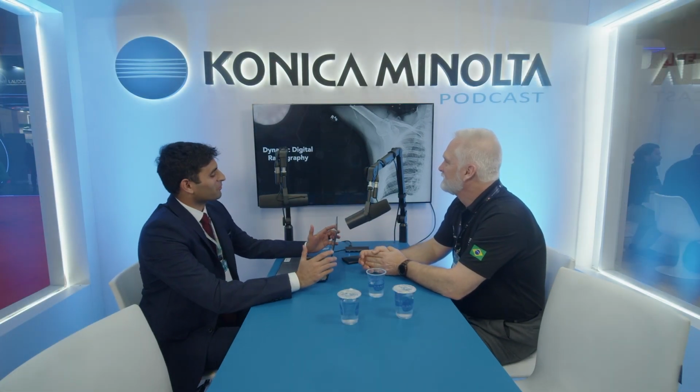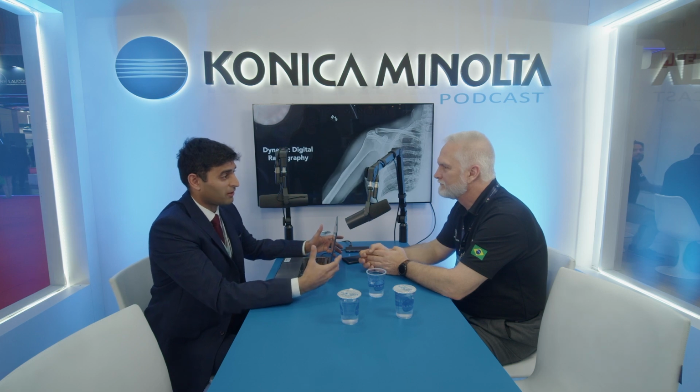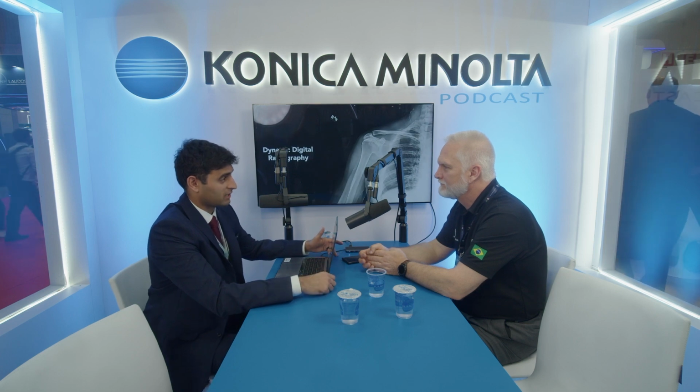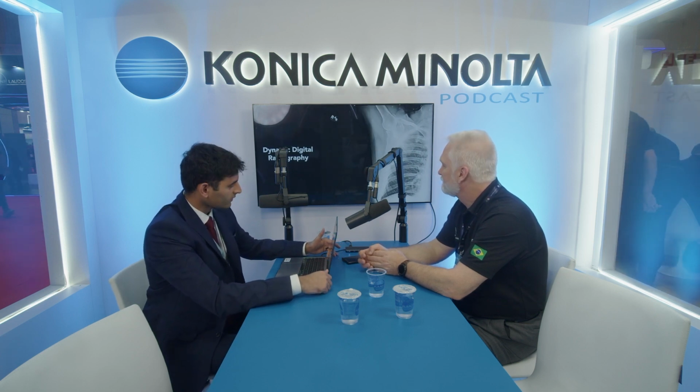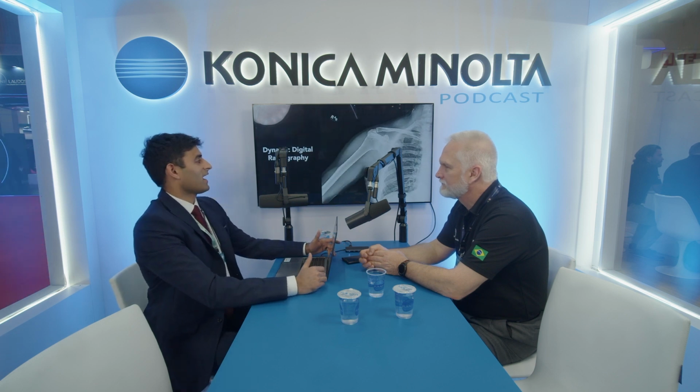So dynamic digital radiography is a novel technology that we use in our clinic at Emory, and it's transforming our understanding of how patient disease manifests and is diagnosed, and also helping us to evaluate how our interventions, operative and non-operative, are helping patients and allowing us to actually make diagnostic decisions. It uses a series of low-dose pulsed radiographs acquired at around 15 frames per second. And by doing that, it allows us to observe dynamic joint motion, as I'll go on to talk about.